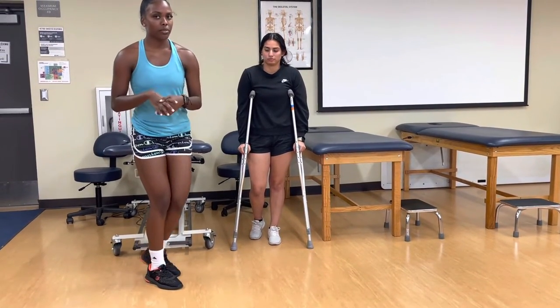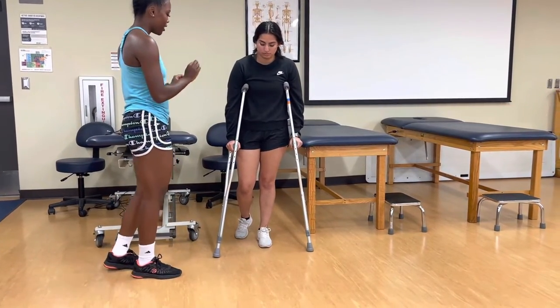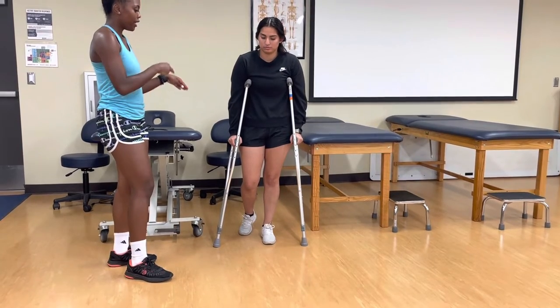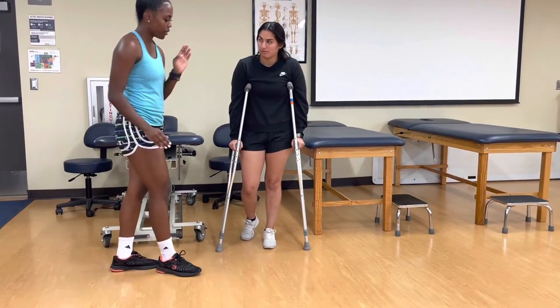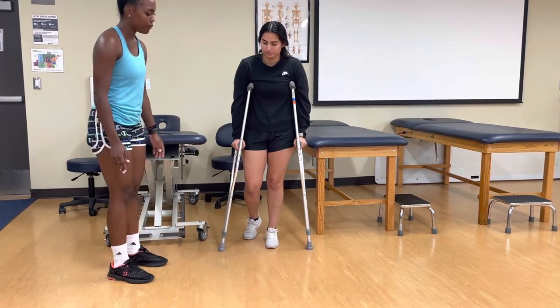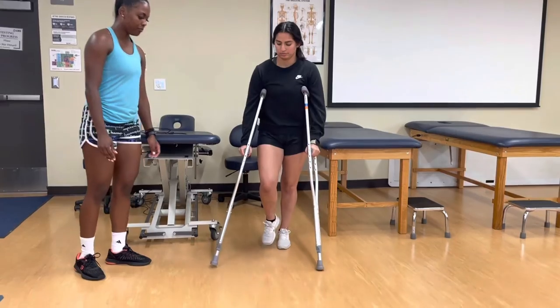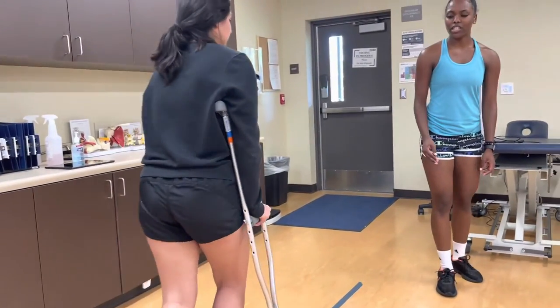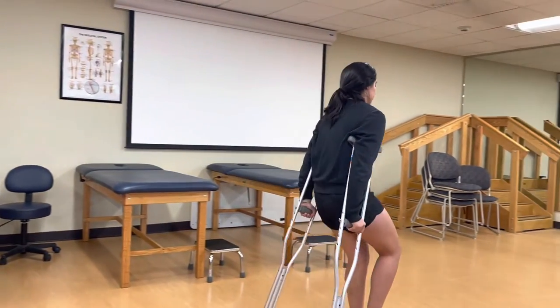Now I'm going to explain to Donna Reese how to walk. The crutches and the injured leg act as a pair. When you lean forward to start walking, your crutches and your injured leg will come forward, and then you'll follow through with the uninjured leg. Make sure you're bearing all of your weight on your uninjured leg and on your hands instead of your axilla pad. The crutches should come out 12 to 15 inches out in front of you. Also communicate to the patient not to look at their feet — look straight ahead. The crutches go first and then the uninjured leg follows.